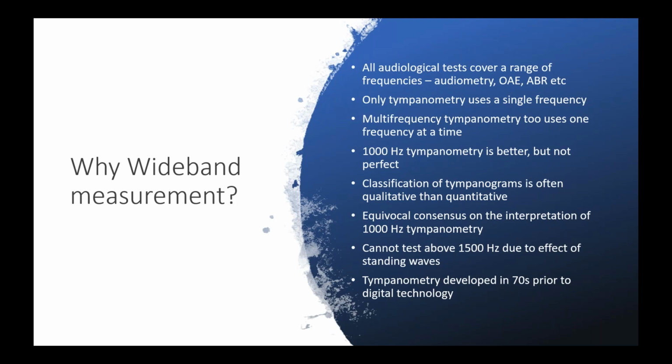I'm not condemning tympanometry, but what I'm saying is, when we have so many advancements in all aspects of audiology, it's time for us to question or challenge tympanometry and see what else we can use instead of tympanometry. So that's what brings us to the wideband measurements.